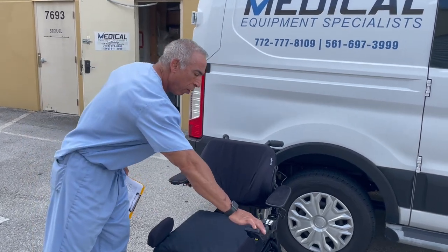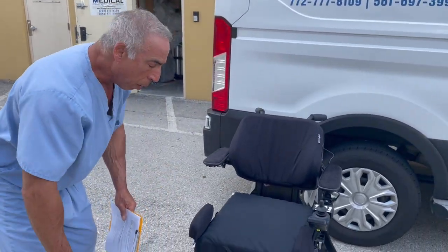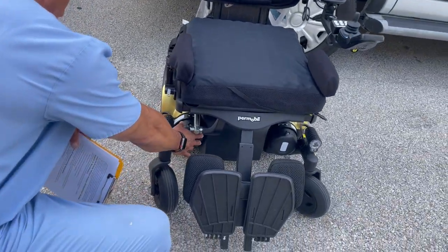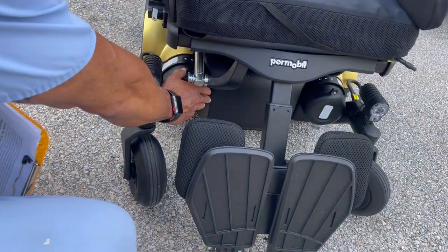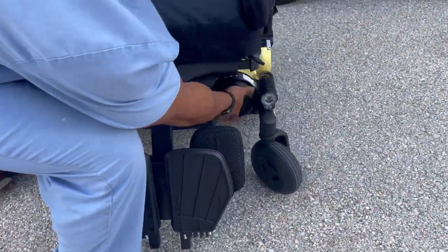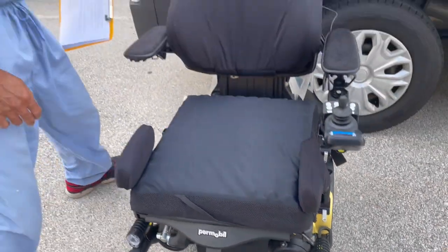First, we'll turn the chair off and go to the motors. There are two motors — a left and a right motor. On this Permobil, it's a little click and you go to the center. On the left motor, we do the same — we go to the left. Now it's in neutral.